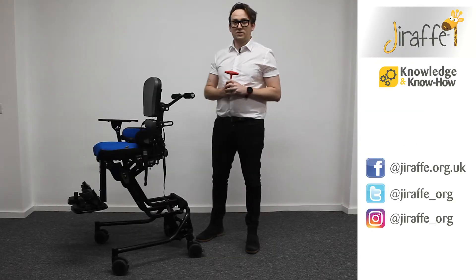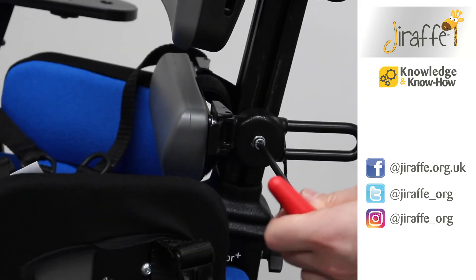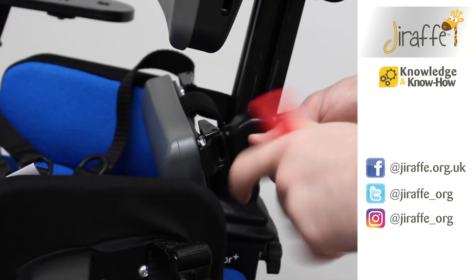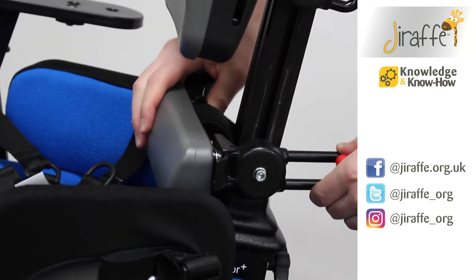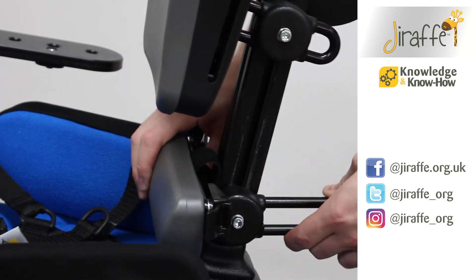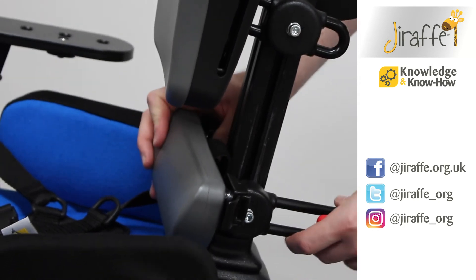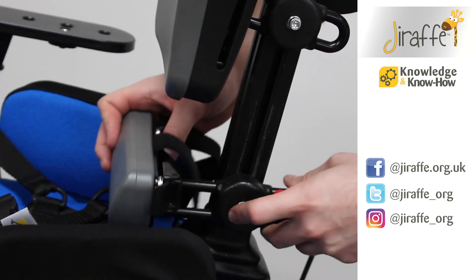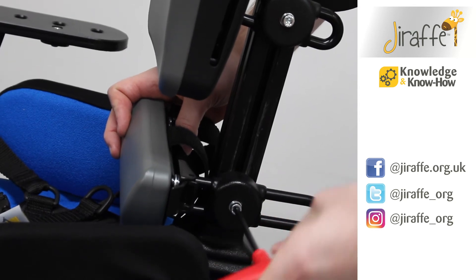Adjusting the lumbar pad on the Junior Plus, we need our 5mm allen key. Simply loosen off the adjustment, and then we have movement out and in — we can move it up the column wherever we need it to be, and we're also able to angle it. Once you've found the location that you would like, you can then tighten the fitting.